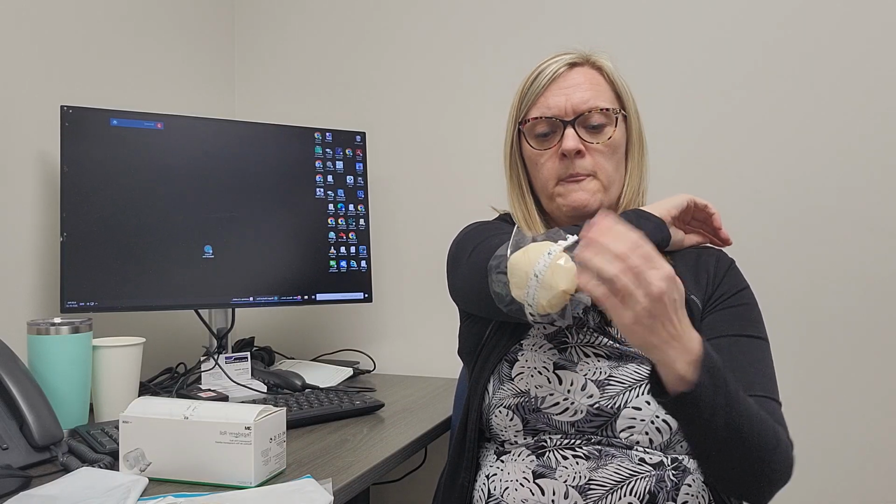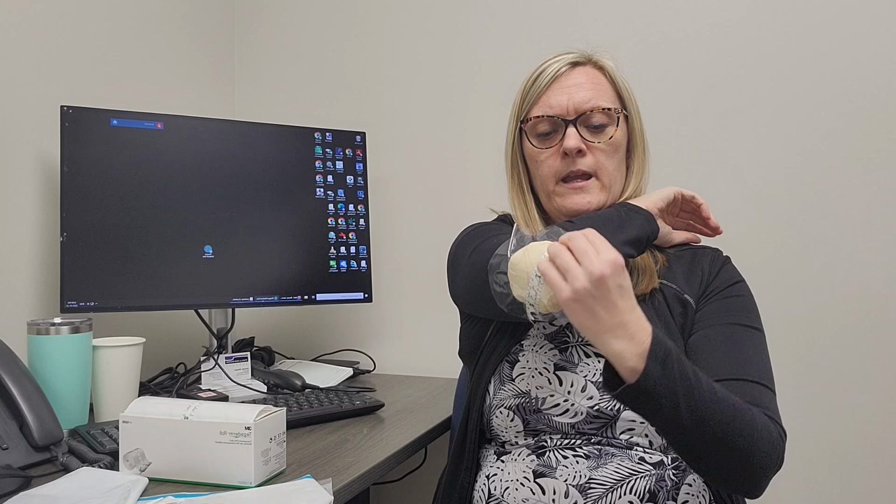Again, that benefit of not having anything adhering to the wound, especially if their skin is sensitive to it, or if you have the potential of pulling, I'm able to pull the back off. I place this in here, right in the middle. And these little pieces on this foam, these are actually just stabilizers. They're so that if I just pulled this off, the whole thing would kind of go up in a ball. So we have that with the backing on here, so it's stabilized. And then you're going to place it directly onto the patient, and you can mold it around, and then you'll end up taking the backing off.